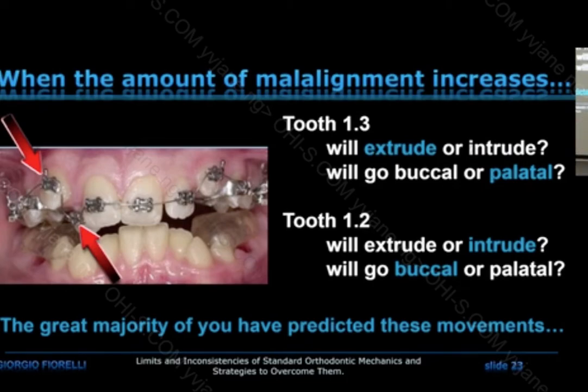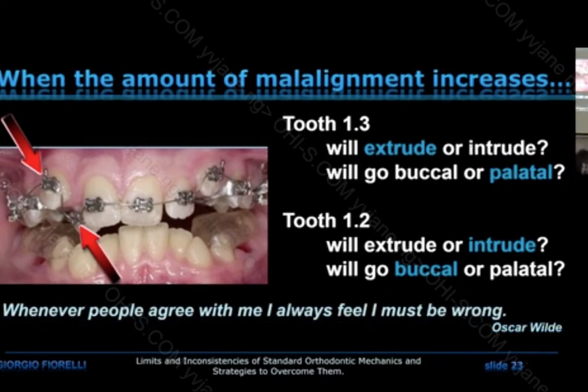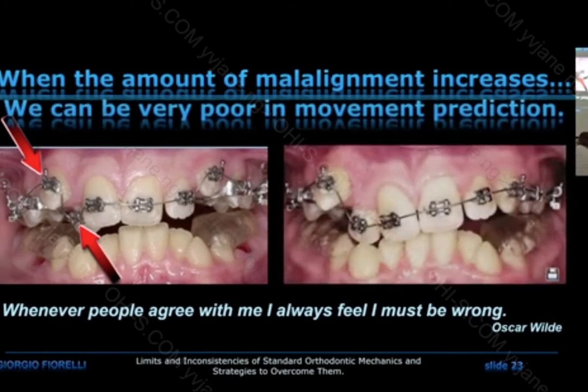So I don't really need to test you again on this. Oscar Wilde was saying, whenever people agree with me, I always feel I must be wrong. So if everyone thinks the same things, maybe there could be some problems. And that's what happened. So actually the canine went out, but not palatally, and the incisor was not intruded, was even extruded, besides what happened to all these teeth.